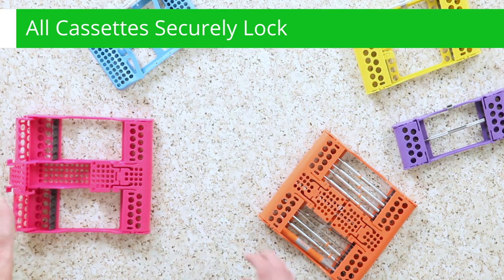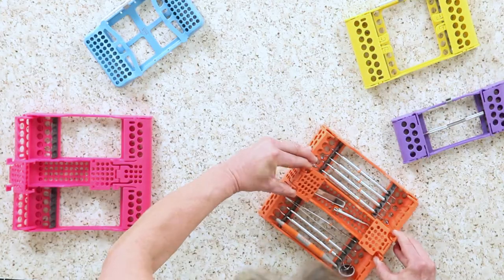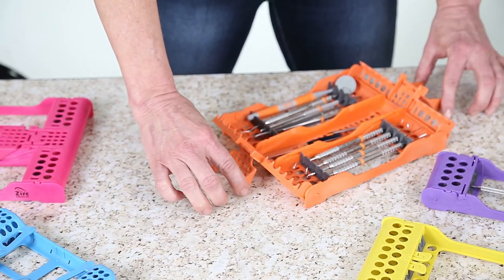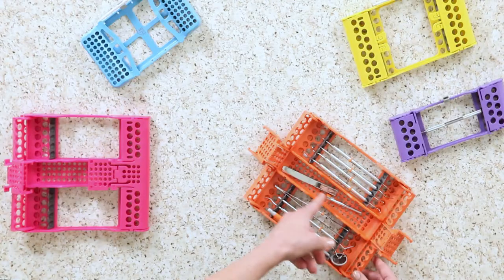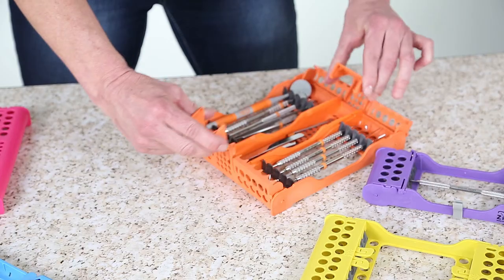Now these two are our 10-place cassettes. To open, you simply pinch them here and slide it open. The center column in the cassette provides additional storage, which works well for extra hand instruments. The cassette can be closed to lock everything in its place.